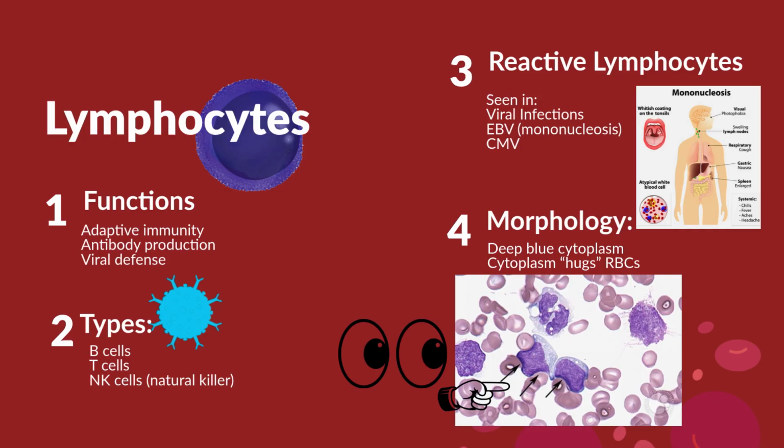Let's talk about lymphocytes. I like how this nice little refresher here helped me realize some things. When I was calling these reactive lymphocytes, I was correct. People can get these confused, where you see I have the eye and the hand pointed. These are reactive lymphocytes. Reactive lymphocytes like to cuddle the RBCs, and what are they doing? Look like they're trying to smother them, and literally they are cuddling all these RBCs.